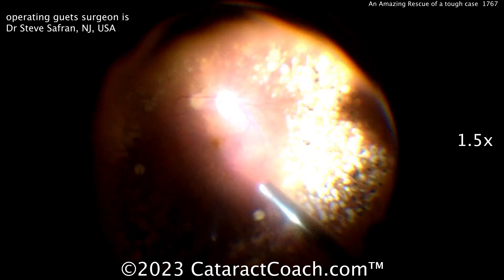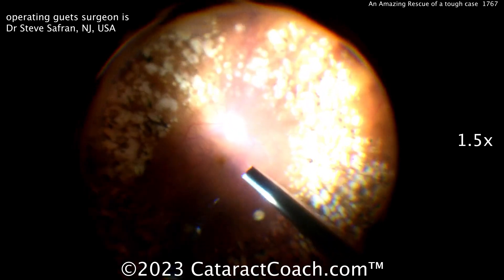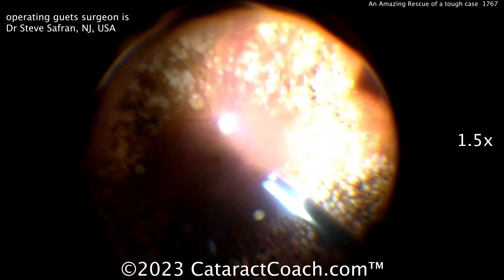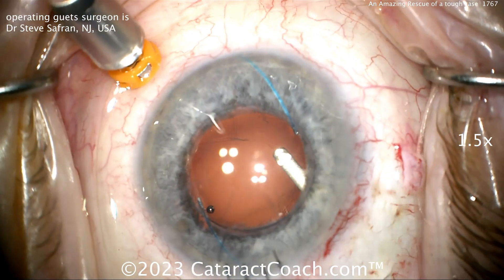You can see the retina — the patient has had a lot of pan-retinal photocoagulation, diabetic PRP in the past. So this is not a completely healthy or normal eye. Now he's coming back up, cleaning up the remaining capsule.